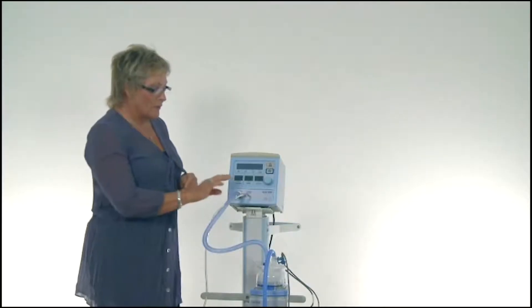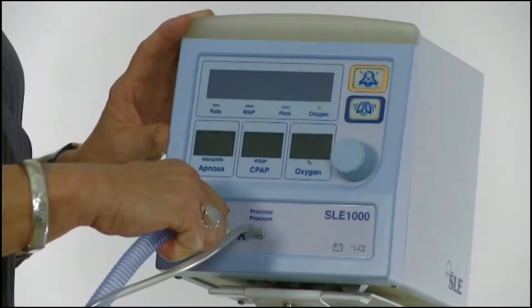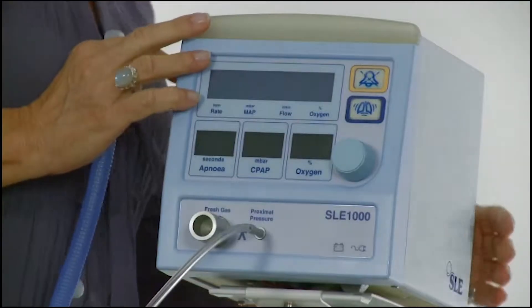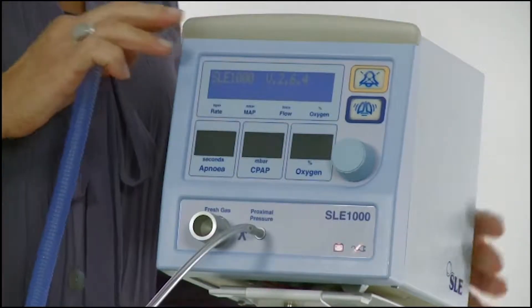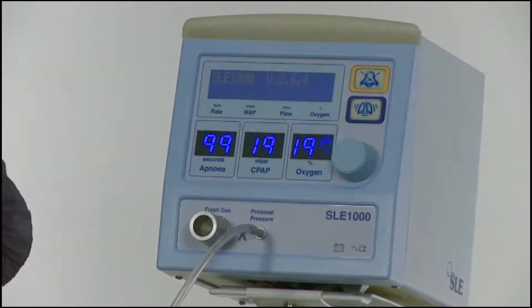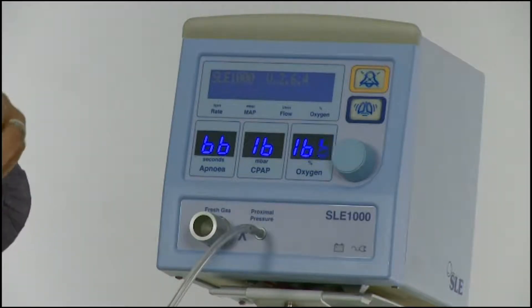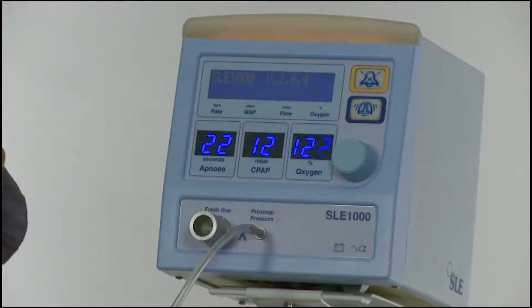Startup: before powering on the unit, remove either the fresh gas line or the proximal pressure line to allow the unit to enter into its two-stage pneumatic self-test. After the initial burst of air, which you will hear, the proximal pressure line or the fresh gas line can be reconnected to the unit.